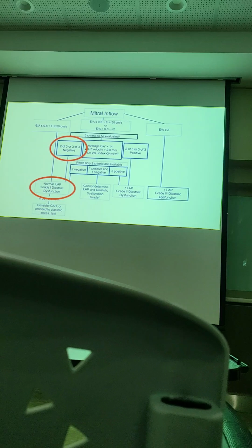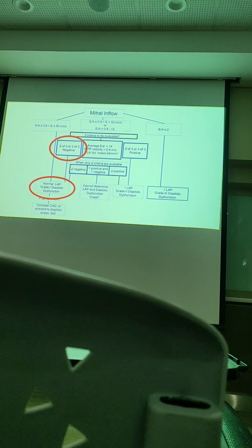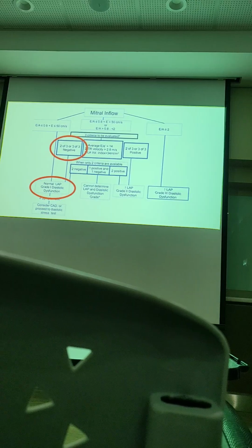Okay. So kalau patient is symptomatic, then we have to consider diastolic stress testing. Because grade 1 are usually asymptomatic. Because in grade 1 usually the LA pressure won't be high. So you won't have the sequelae of the heart failure, you won't have all the reduced effort tolerance, the overload semua.